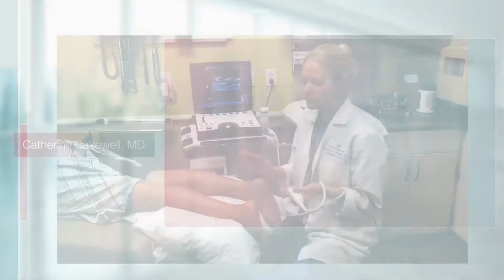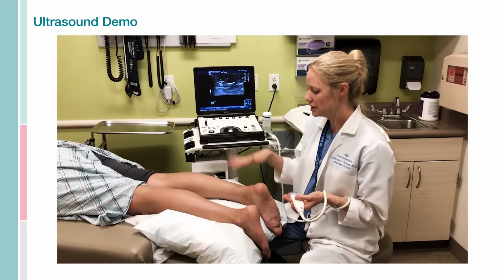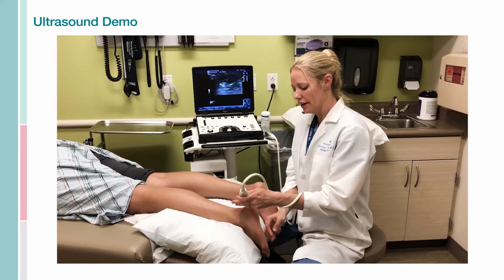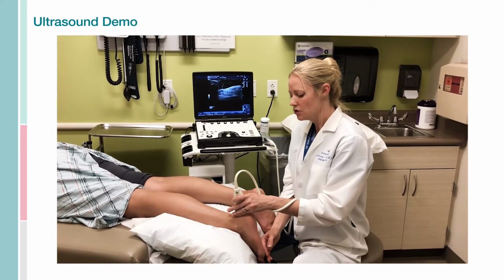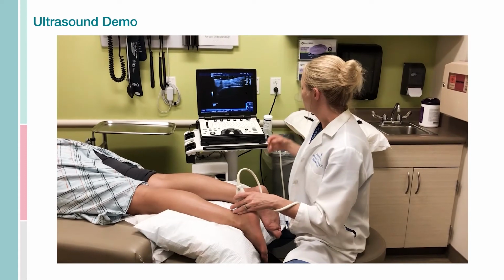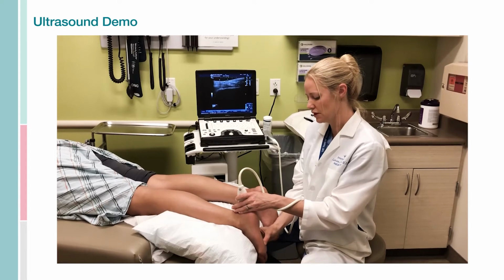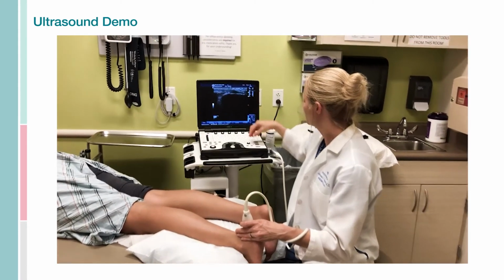In this short video, I will demonstrate how to examine the enthesis of the Achilles and show you what features we typically look for. So the next enthesis we'll examine by ultrasound is the Achilles. You notice that I've placed the patient prone to have better access to the back of the ankle, and I just let them relax, hang neutral in that 90-degree position. You can, if you want to, bring out grayscale abnormalities, have them dorsiflex the foot. So I'll say if you can bring your toes a little bit up to your head. There you go. That does put a little bit more tension on the Achilles.